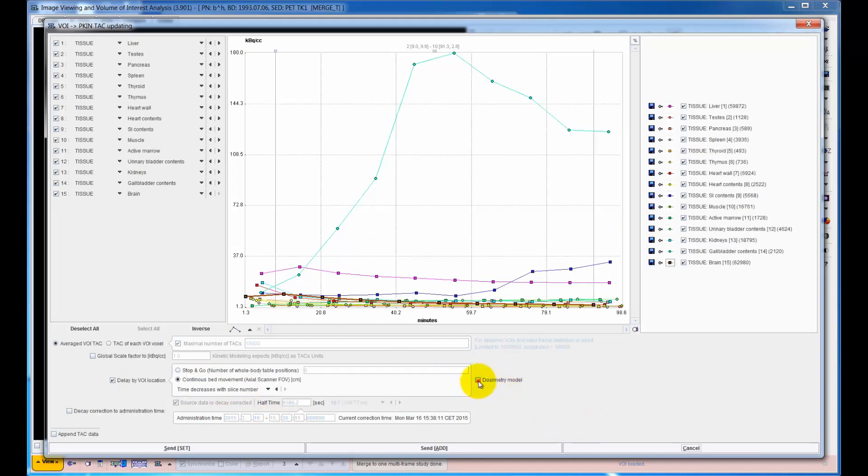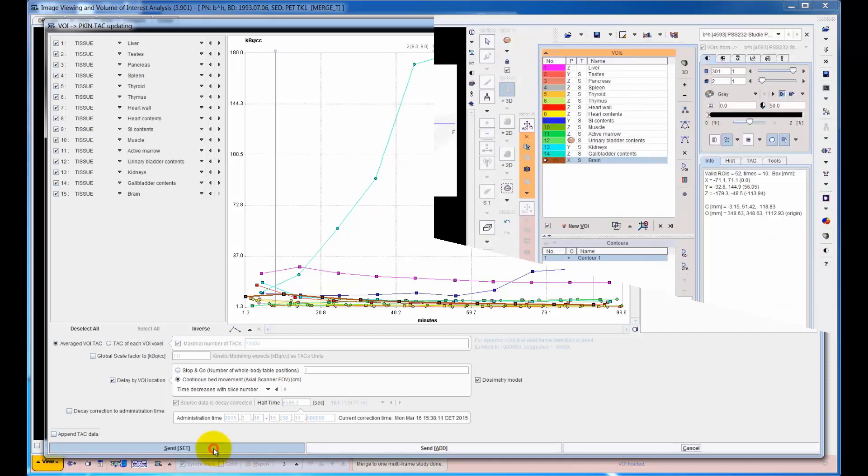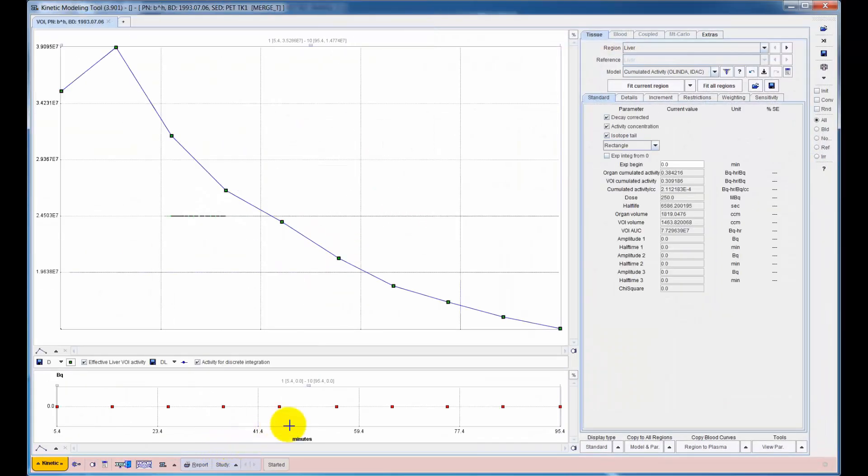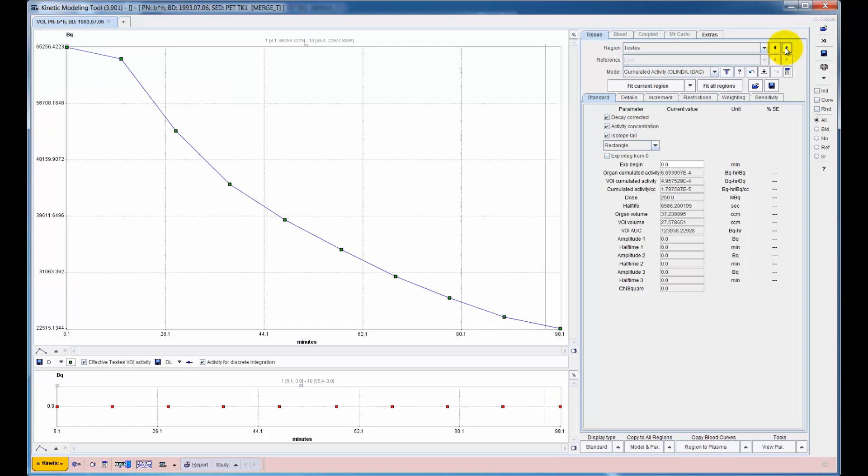The uptake curves are then transferred to the modeling tool and opened in a specific model for calculation of the accumulated organ activity.